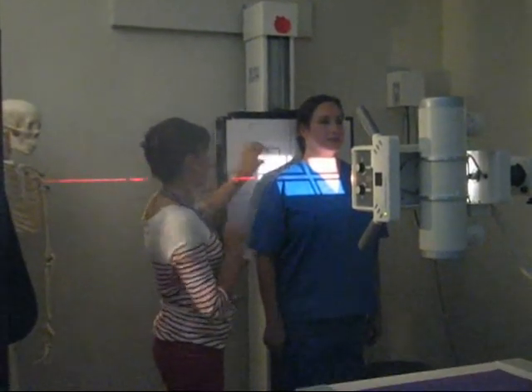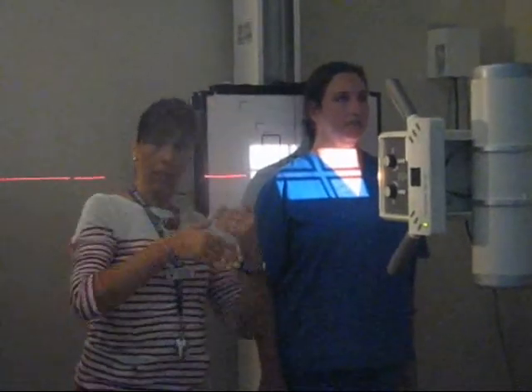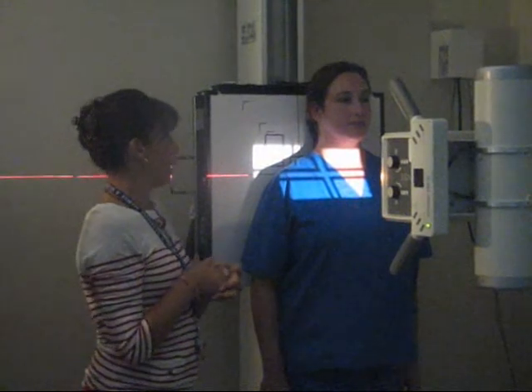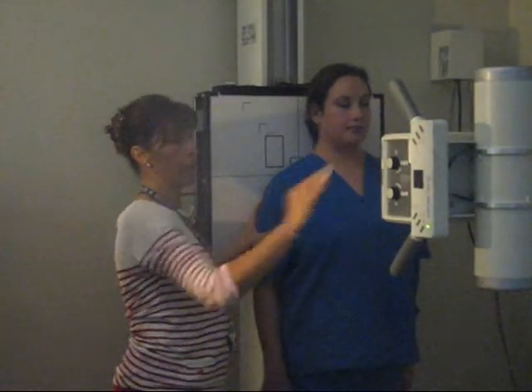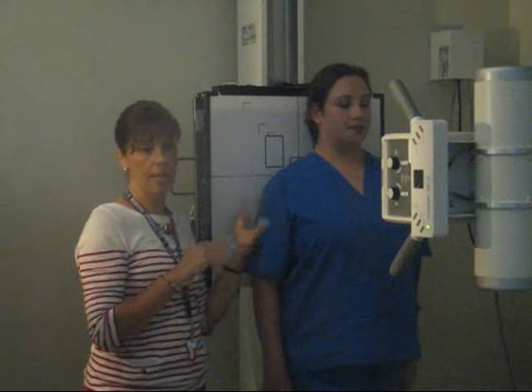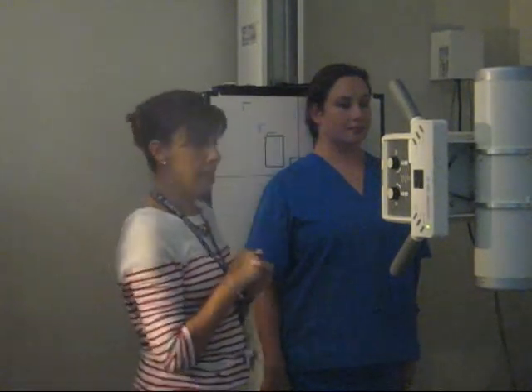Okay. Now, because the clavicle is a rounded, 3-dimensional bone like all the other bones, we sometimes need to see it in different perspectives. Of course, I'm going to back up a little. You can have this study done whether standing or laying down on the table. It would be the same thing.